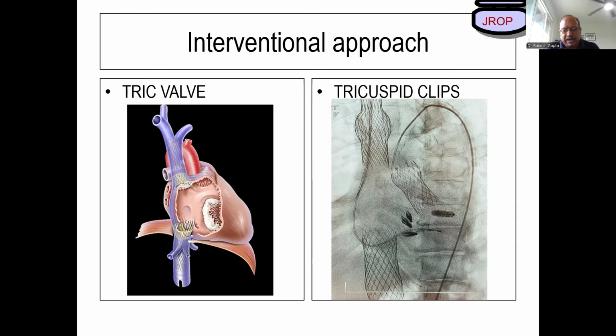So clinically, he was in shock, and I thought that was because of the LV. But LV was not so bad, it was maybe 40% ejection fraction, what we were able to calculate. But the patient was in shock. Probably I was thinking RV, and I was expecting the RV to dilate, but RV dilatation will not be there. There will be a reduced RV systolic function. You will see RV dilatation when you have a primary pathology of the RV, like a patient presenting with pulmonary embolism. Yes, acute cor pulmonale.